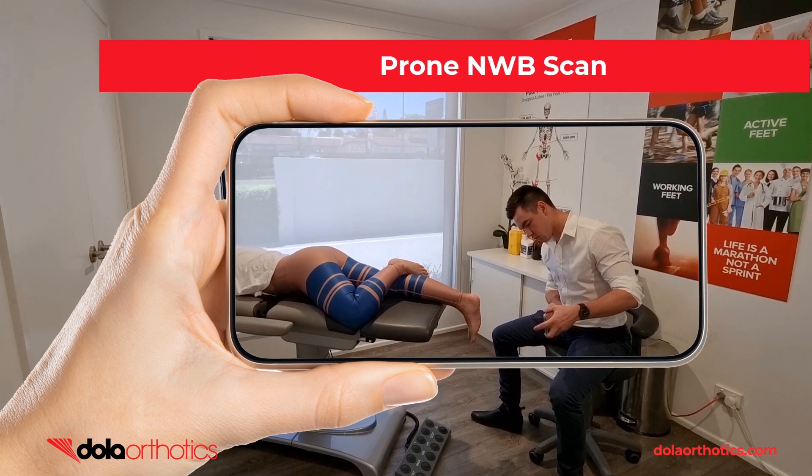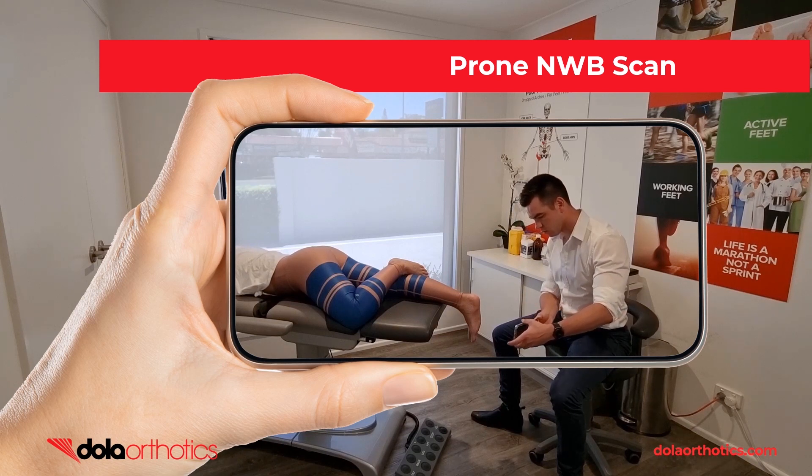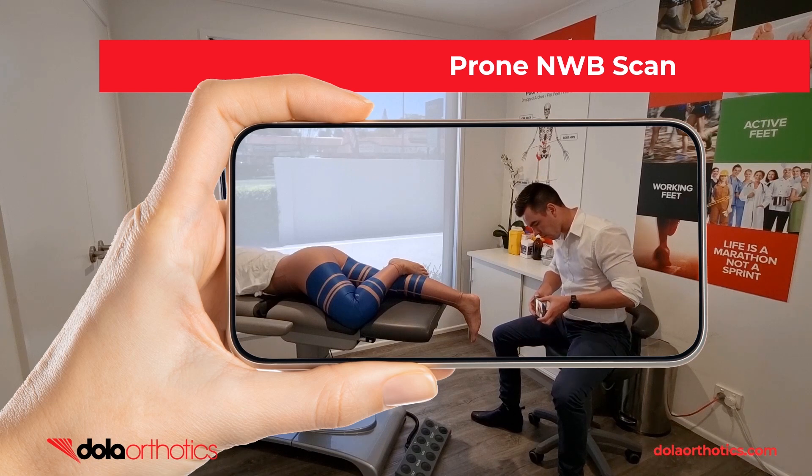Here is a demonstration of the iPhone being used to capture a prone patient non-weight bearing foot as positioned by the clinician or as strapped in treatment directed testing. Move the phone to capture all aspects of the foot and assess prior to submission.